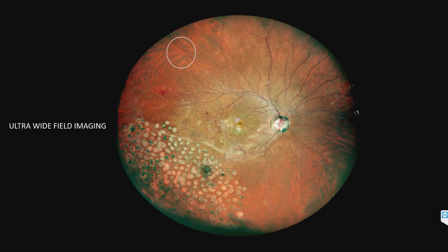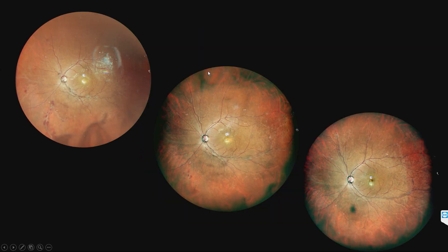Ultra-wide field imaging with multicolor — any imaging which shows between 100 to 200 degrees of field is ultra-wide field imaging. Wide field imaging is from the posterior pole up to the equator or the vortex ampulla. Ultra-wide field imaging helps in diagnosing and documenting peripheral retinal lesions and in following up cases. This is a case of peripheral retinal vasculitis which was followed up over three years and did very well with mycophenolate mofetil.